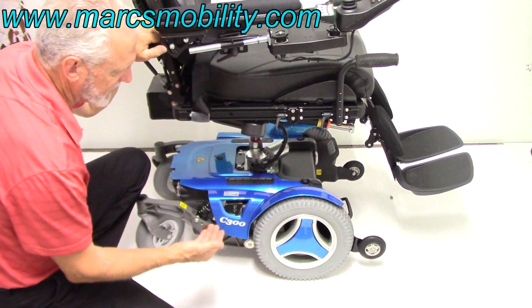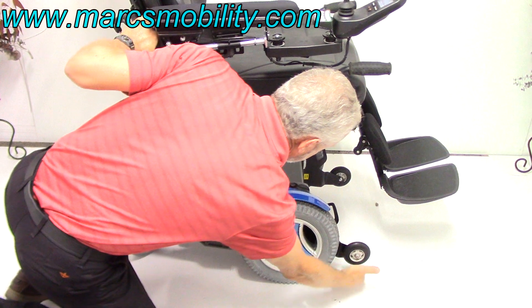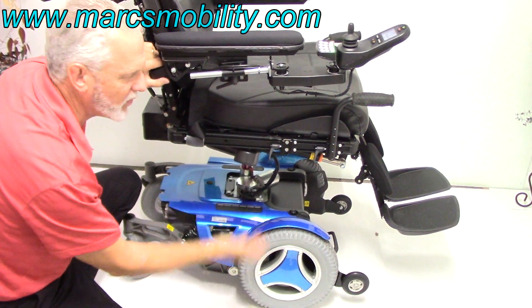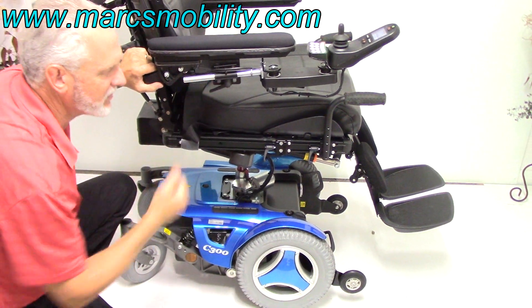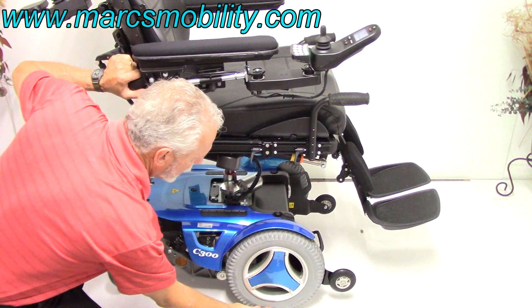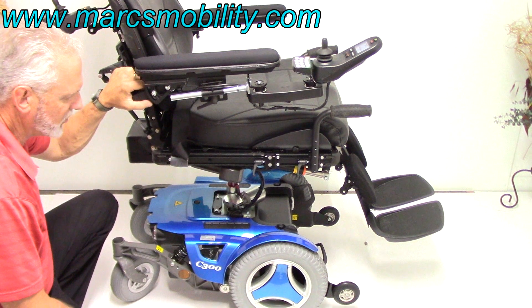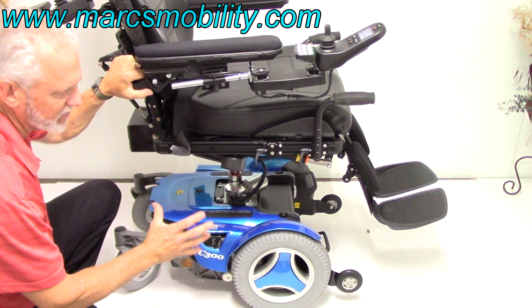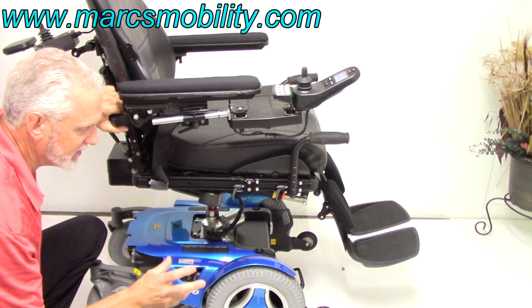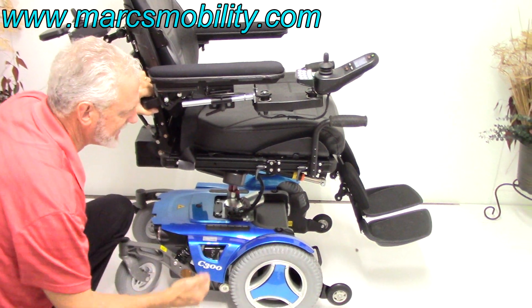On the C300, this is called a front wheel drive, meaning there are no wheels on the ground here — this is only a tip wheel. This is really good for outside because if this chair weighs 400 pounds and you have a 300-pound user, that's 700 pounds of transferred weight onto the wheel, giving you good traction in the grass or wherever you're using it. I like these types of chairs for outdoor use. They don't turn quite as well inside, but if you want a good balance of outdoor and indoor use, this would be a good one.